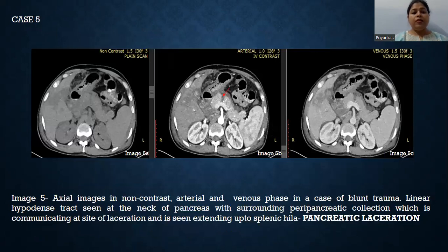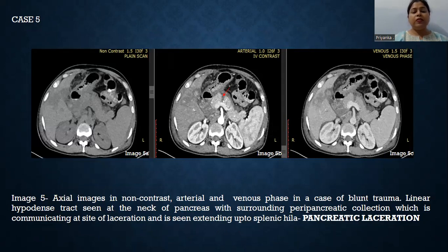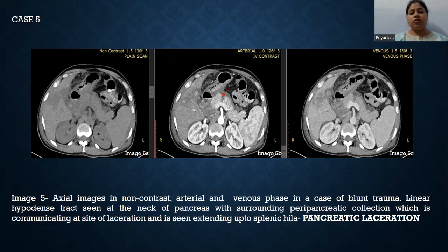Case number five shows axial images in non-contrast, arterial, and venous phase in a case of blunt trauma. There is a linear hypodense tract seen at the neck of the pancreas with surrounding peripancreatic collection, communicating at the site of laceration and extending up to the splenic hilum. These findings in view of the history are suggestive of pancreatic laceration.